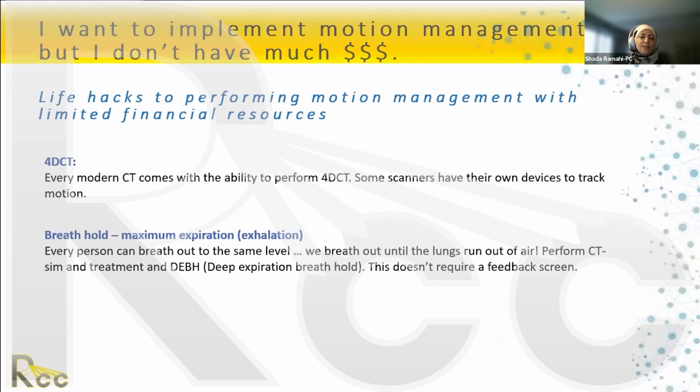If you go to a CT simulator that you bought within the last 15 years, it already comes with its own equipment for motion study. Recently I consulted for a private clinic that had bought a CT sim back in 2006, and they didn't know that they already had the belt that you can use to do 4D CT. And they already had the software, and it was part of their maintenance contract.